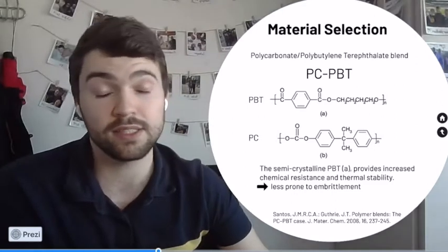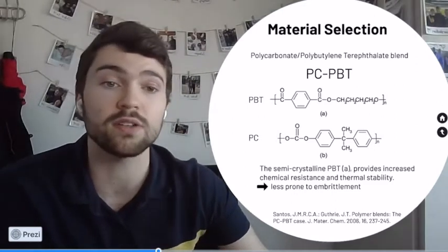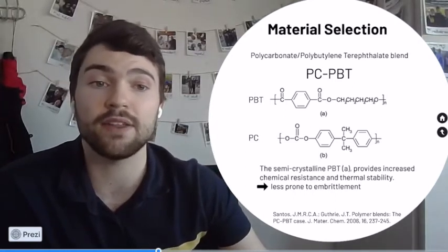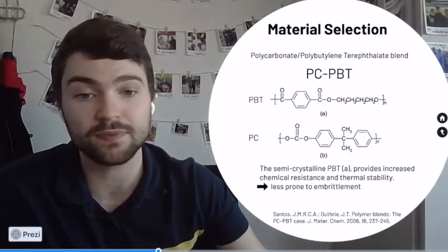This increase in chemical resistance means that the 3D printed components of the laryngoscope can go through more disinfection cycles without losing their mechanical integrity. And the increased lifespan therefore offsets the slight increase in cost associated with this material choice.